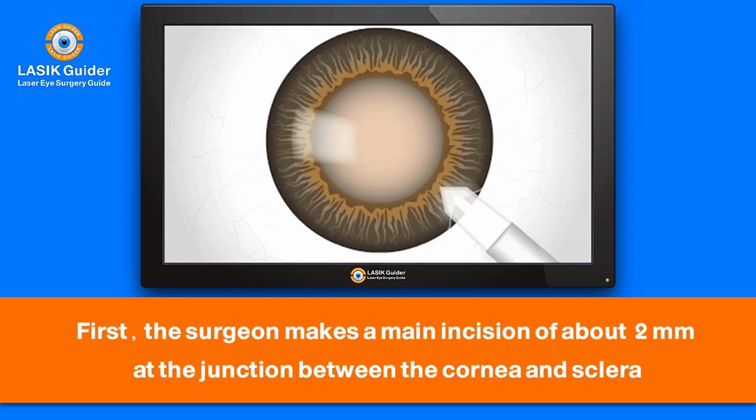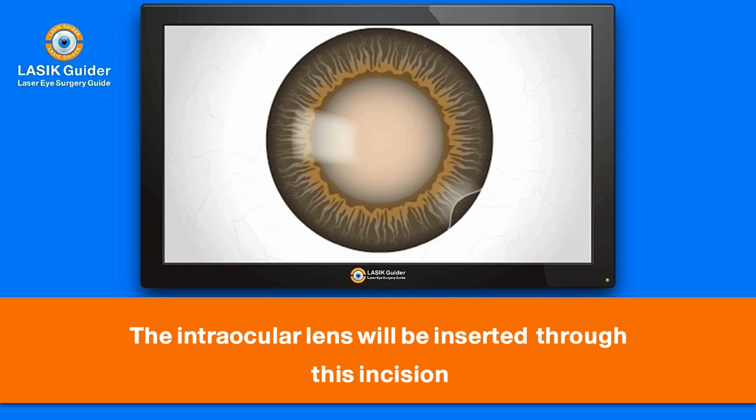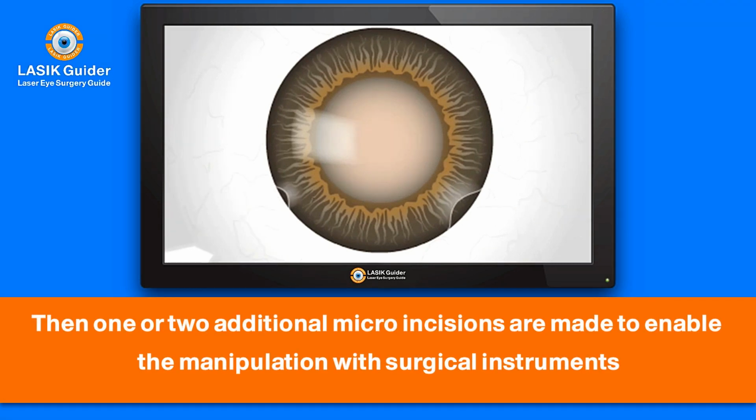First, the surgeon makes a main incision of about 2 millimeters at the junction between the cornea and sclera. The intraocular lens will be inserted through this incision. Then 1 or 2 additional microincisions are made to enable the manipulation with surgical instruments.